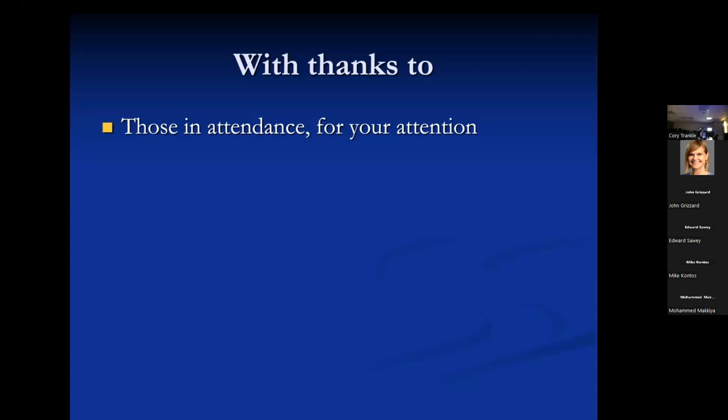My advice would be to take down your field of view. You can take down the imaging matrix, which will save you a little bit of time, because you're going to need that time to do oversampling in the phase sense. And that will often help in terms of imaging small structures on the valves.